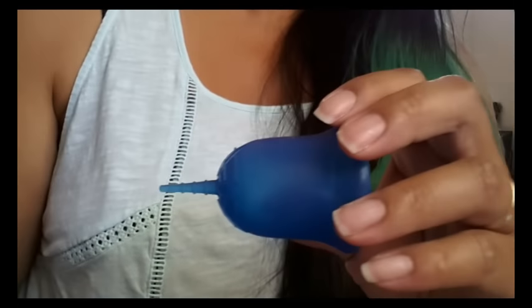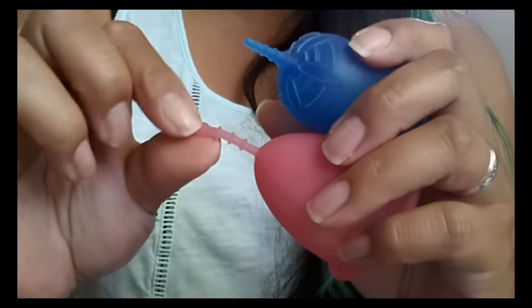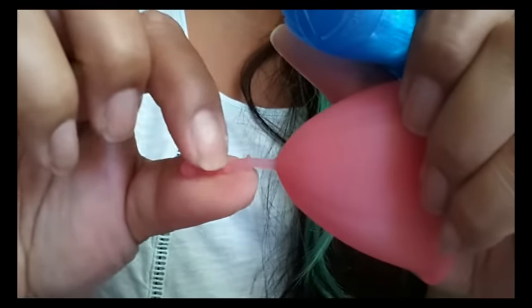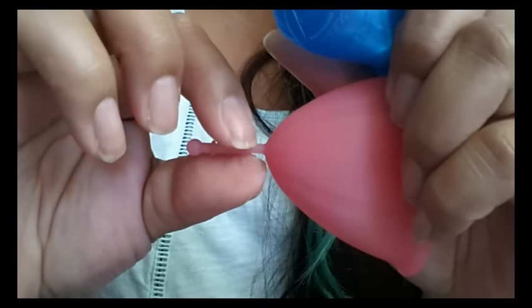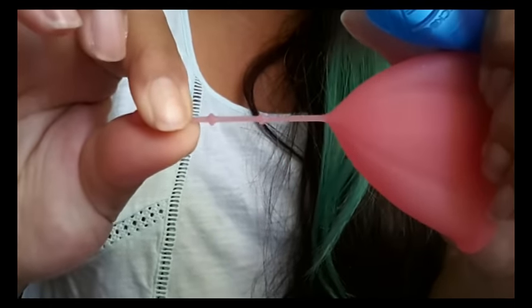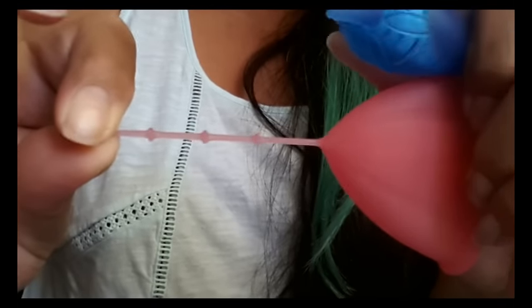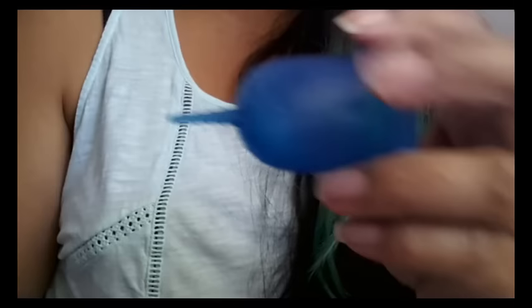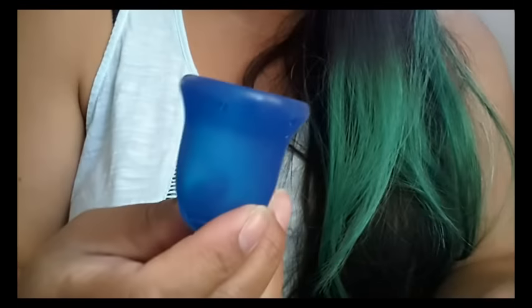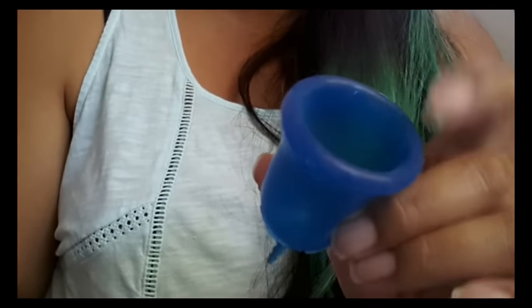I really think that if they put a little ball on the end — like the Sibel cup has — it would make a big difference. The Sibel has this ball and a really stretchy stem as well, but their grip rings are a little harder so your fingers can grip onto them. That ball really makes a big difference when trying to use the stem to move the cup down so you can reach the base. Other than that, this is a really nice, comfortable cup and I do recommend it to anybody. At least try it.